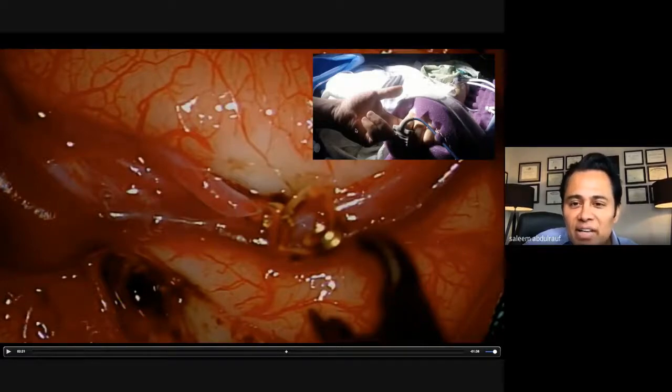We have a translator in the room, okay, because this patient is from overseas. He's telling her to squeeze her fingers. I put a temporary clip on. Now for the residents, this is 100% test.